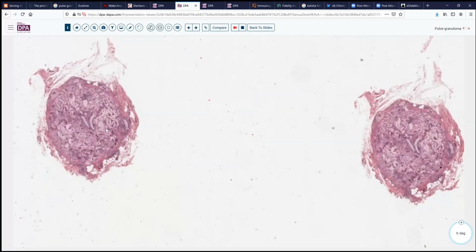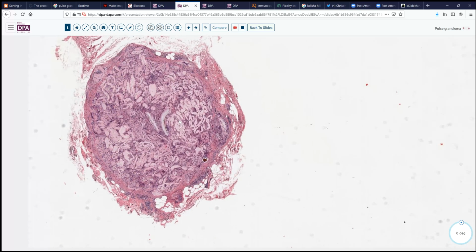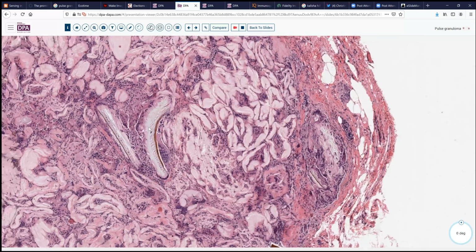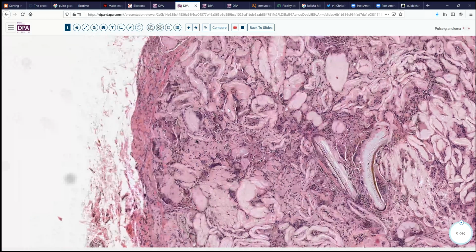So here's another example, this one from the colon and from the pericolic fat, typically associated in those circumstances with a diverticulum. Now here we can see that there's actually some food particle associated with it, some plant material here. And here we see this very serpiginous ring-like or wandering eosinophilic hyaline material, again with a characteristic multinucleate giant cell response.